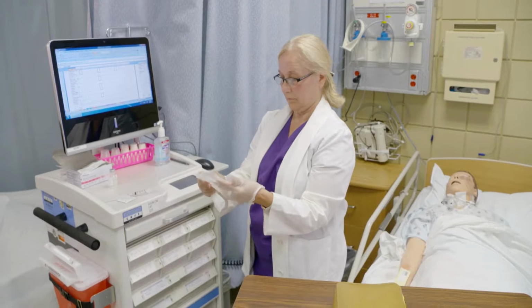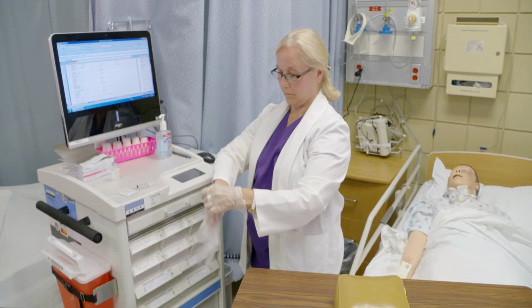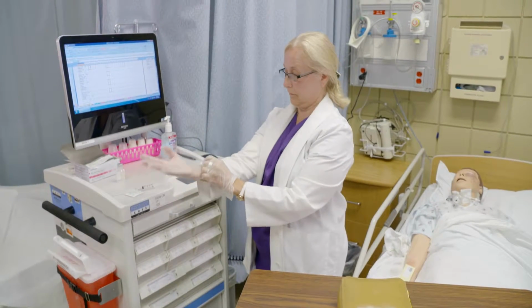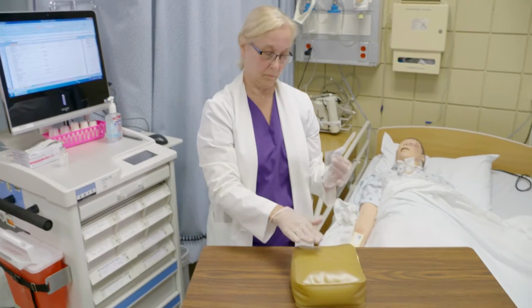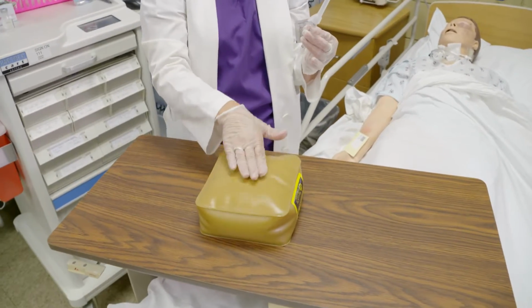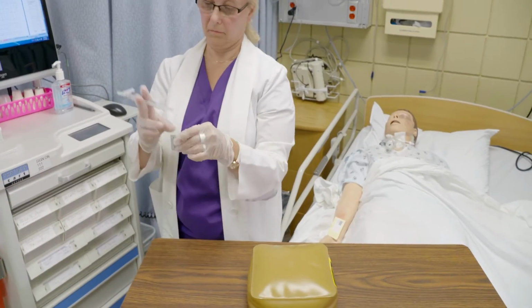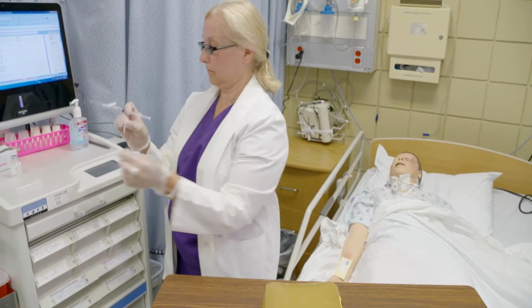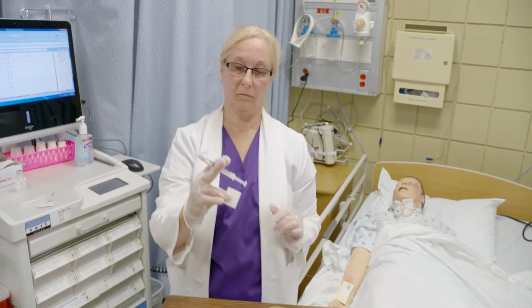Select appropriate site for injection. Please refer to the end of this video for information about correct injection sites. Palpate for masses or tenderness. Hold the syringe in your dominant hand, take off the cap. Make sure the bevel is upward. Hold the alcohol pad between your ring finger and thumb.